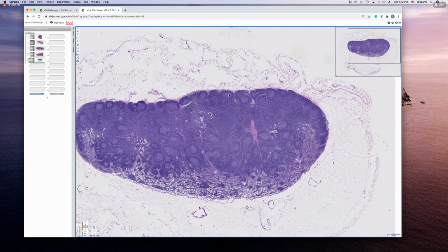So looking at these, would you call these primary or secondary? Primary will be generally dark, okay? The secondary are the ones that will have this germinal center and the mantle zone. These belong to activated lymphatic nodules, okay? Because they are actively generating new cells that are ready to fight against whatever invasion that the lymph node is taking on. So these are all secondary nodules. So that would indicate that this lymph node is being activated.